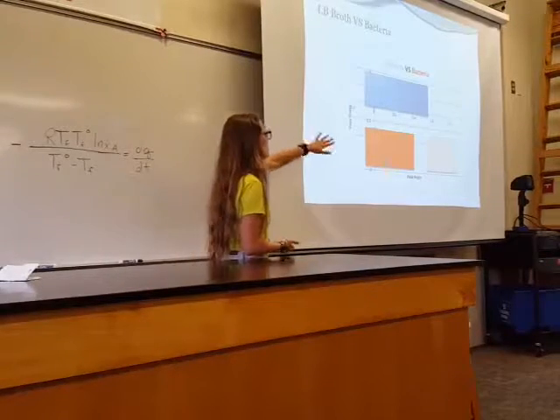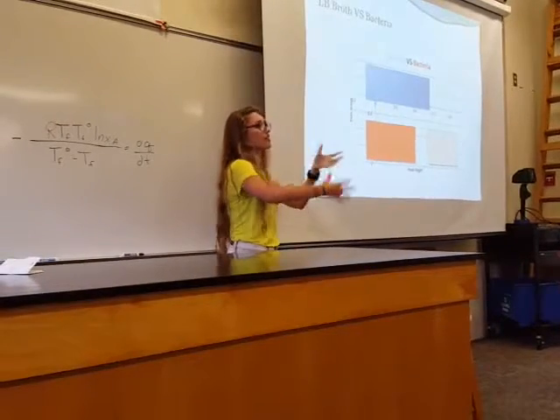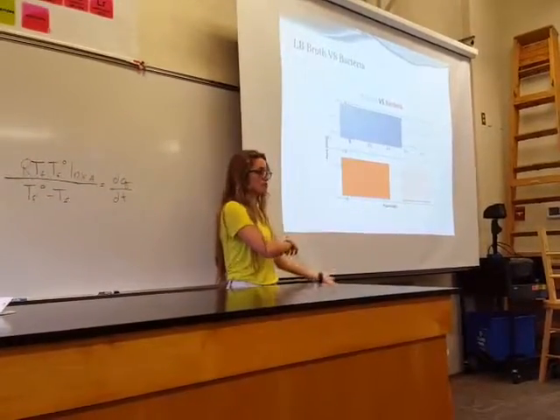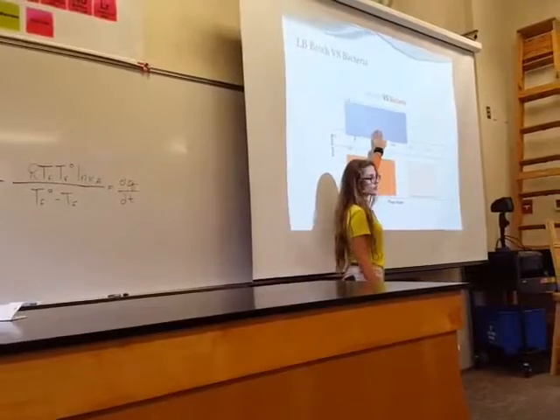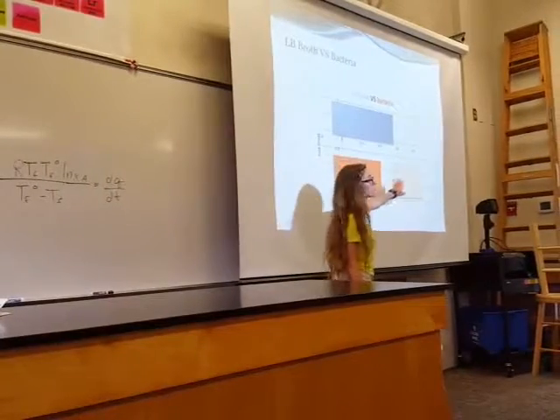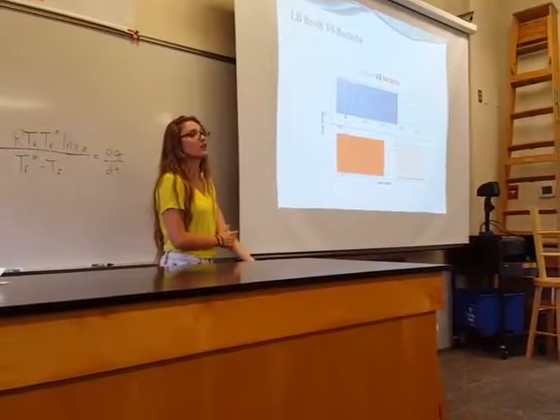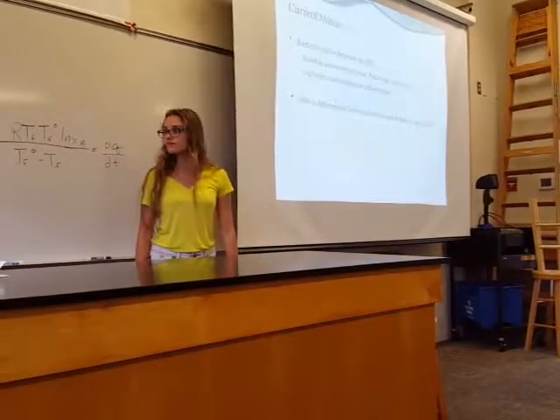And so again, what we expect to see in the future as more trials are done are these 3D parameters that we're able to set, where if we do this for a bunch of different bacteria, and a sample is run on this unknown sample, if you don't know if there's bacteria or not in the sample, if it lands in this area, okay, then there's nothing in it. There's no bacteria in it. But if it lands in this area, then there's Pseudomonas aeruginosa. But if it lands in this area, it's Pseudomonas putida. And the overall idea is to be done for bacteria that could be found in the bloodstream. And so this could be applied to that.